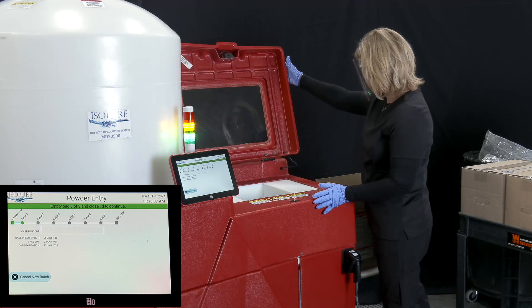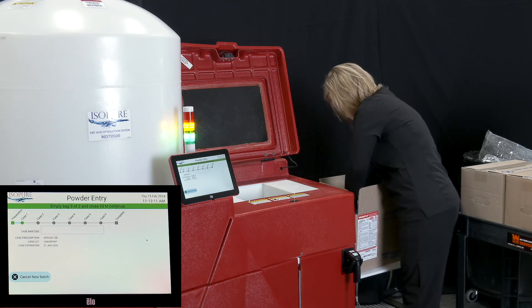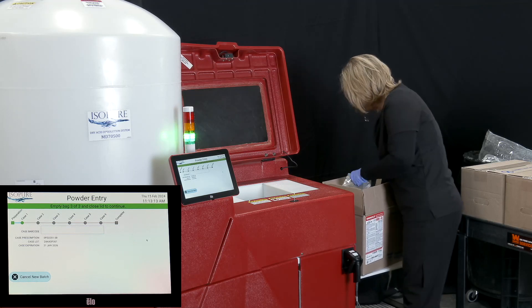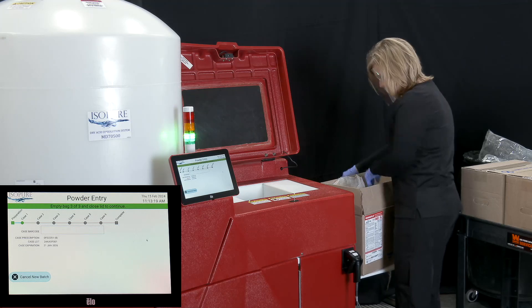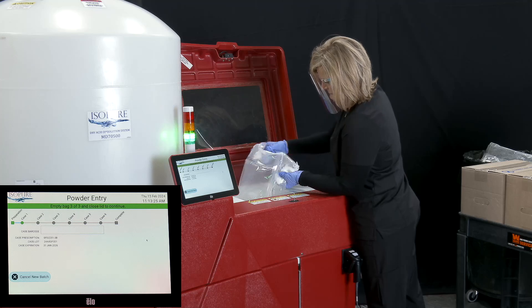Acumix counts the number of cases scanned as well as the number of times the lid is opened and closed. This helps to ensure that the correct number of dry acid bags are added and that the hopper is adequately rinsed between each addition.